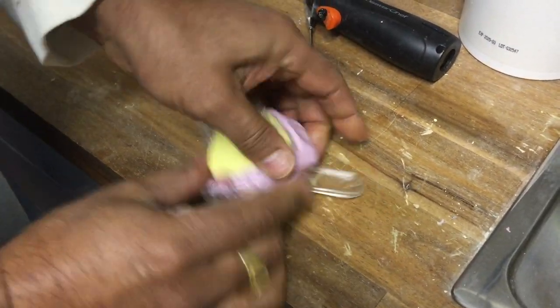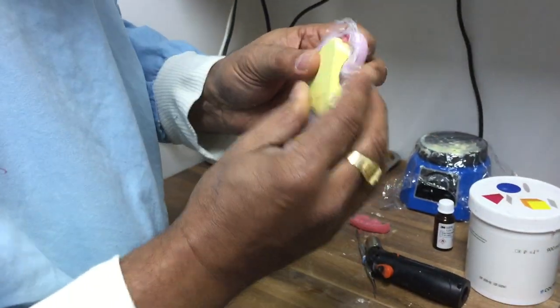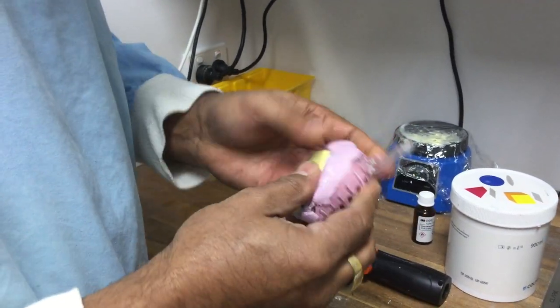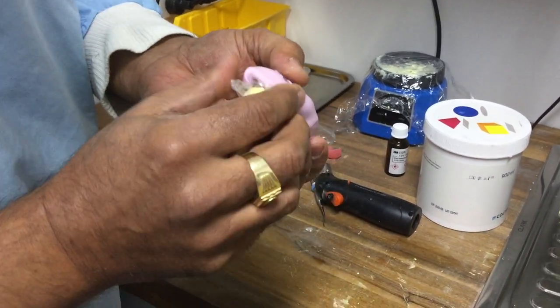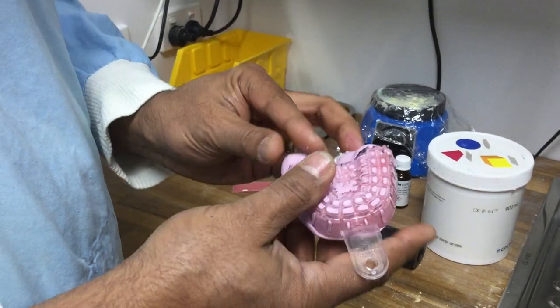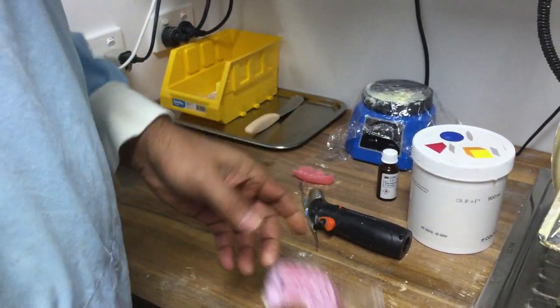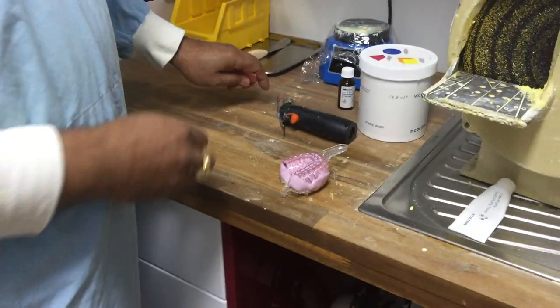Now I push it down into the tray. I'm mostly interested in this front section here, and that's basically pretty much ready. I'm not taking a full arch impression here — if I were, I'd have that tray a little bit longer. We now have to wait for it to set.